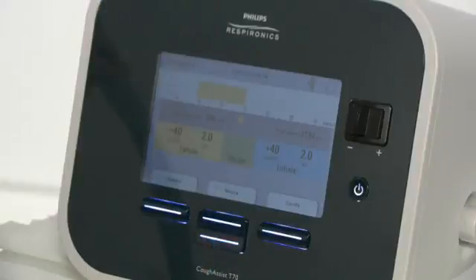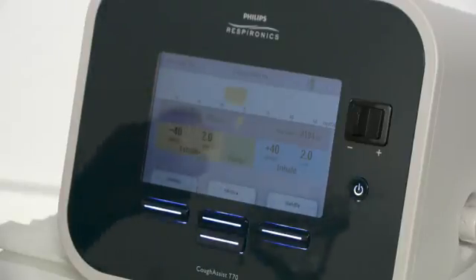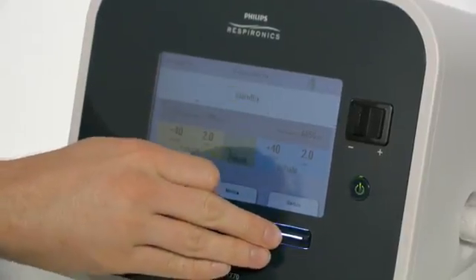CoughAssist T70 will do it for you and display the pressures in real time. Here again, the patient should actively inhale and exhale. You can pause the treatment at any time by pressing the right button under Standby.